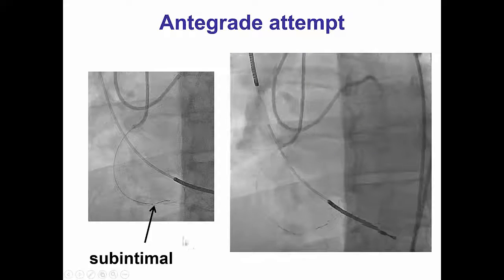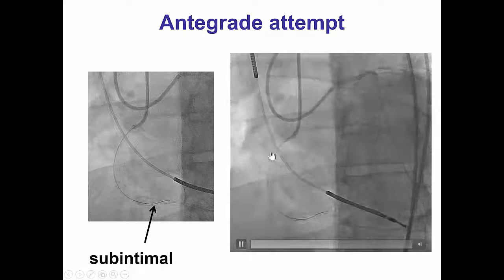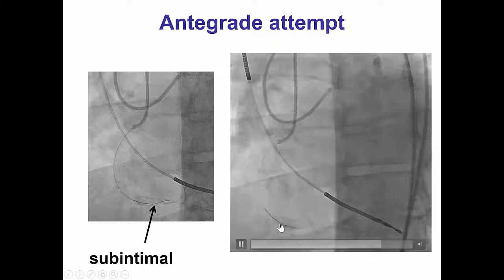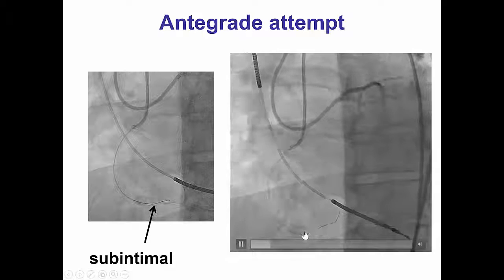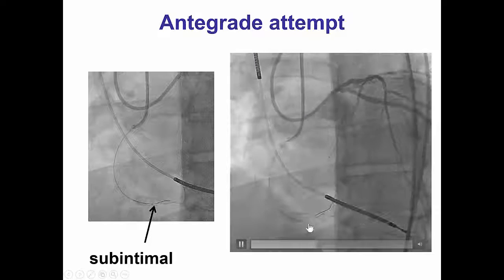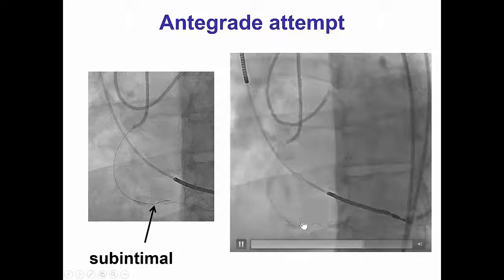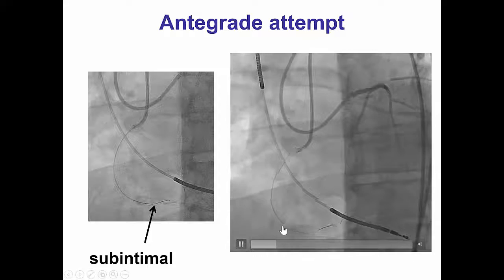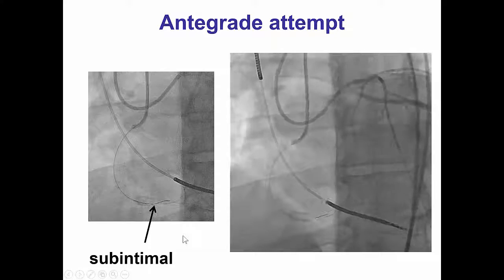We initially tried an antegrade crossing attempt; however, the antegrade guidewire went sub-intimally and we were unable to re-enter into the distal true lumen. As you can see, we have a fairly extensive sub-intimal hematoma in the distal right coronary artery.